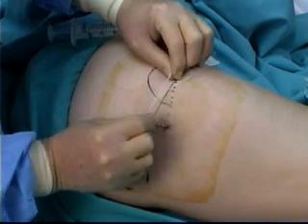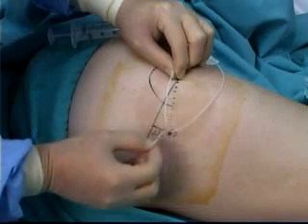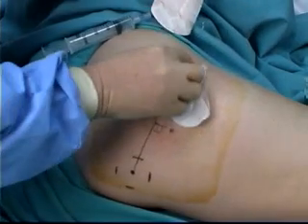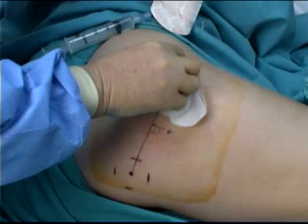Catheter removal is a sterile procedure and is done after the patient does not require the continuous nerve block any longer and after full sensation has returned to the leg. The proximal end of the catheter is fixated with the left hand, and the distal end of the catheter from the skin bridge is removed. This part of the catheter is kept sterile, and the rest of the catheter is removed.